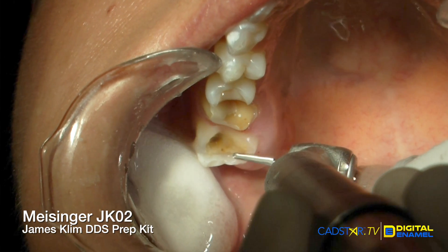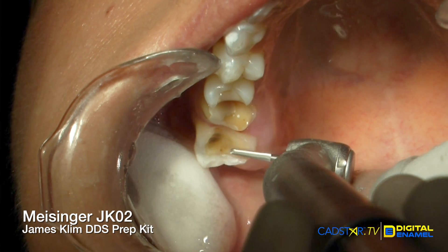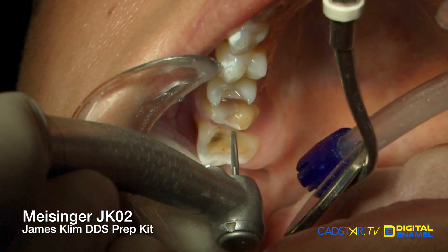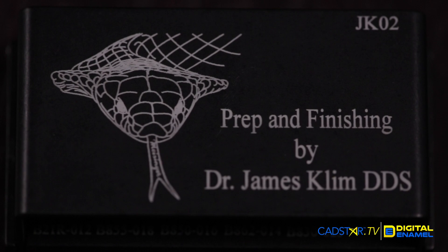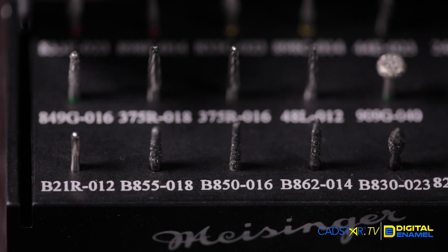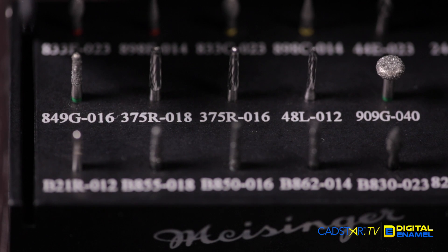Once I complete the bulk reduction of my prep, I move right over to my finishing carbide burrs. You'll find them on the Meisinger JK02 prep kit. These burrs have the same shape as my primary reduction burrs, so it fits right into the flow of my prep cadence.